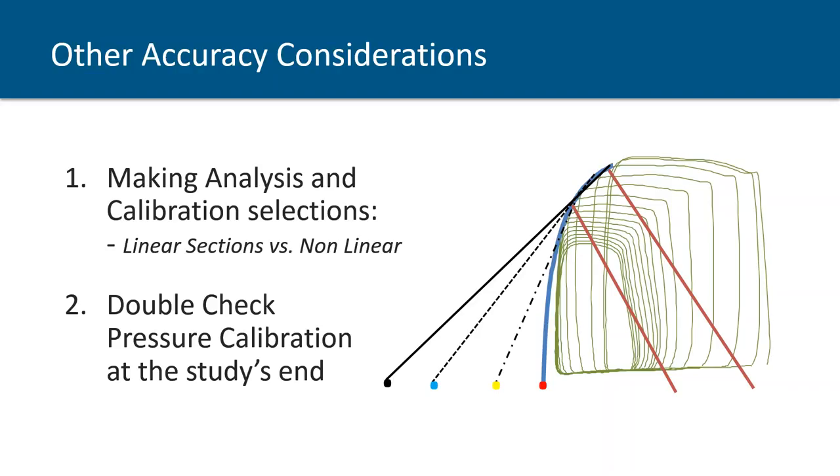You can see from the linear relationships here different values for your V0. This will affect your coupling ratios, as you can see here with the EA values. So it's important to realize this, to understand the analysis techniques that you're applying.